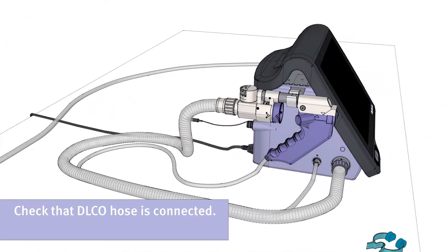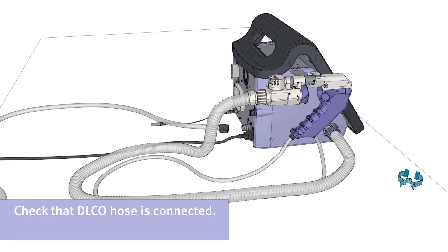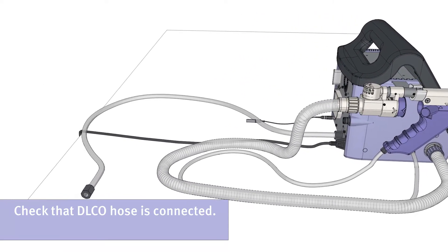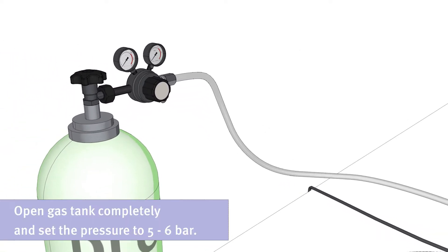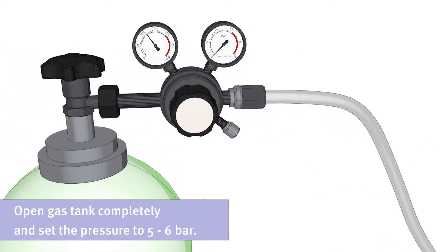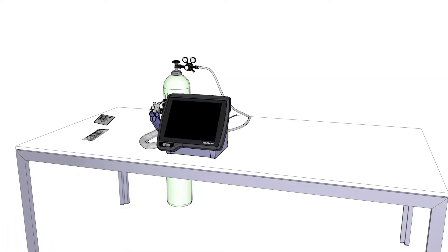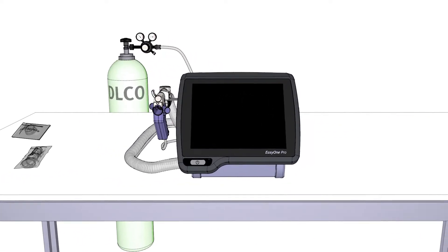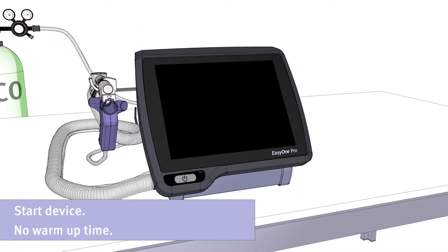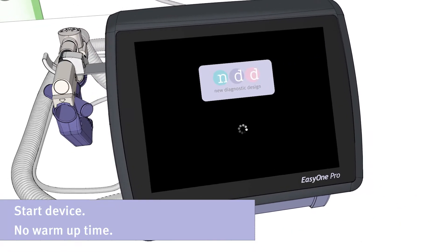Please start with checking that the DLCO hose is connected. Open the gas tank completely and set the pressure to 5 to 6 bar. Now start the device by pushing the on-off button. You do not need to consider any warm-up time.